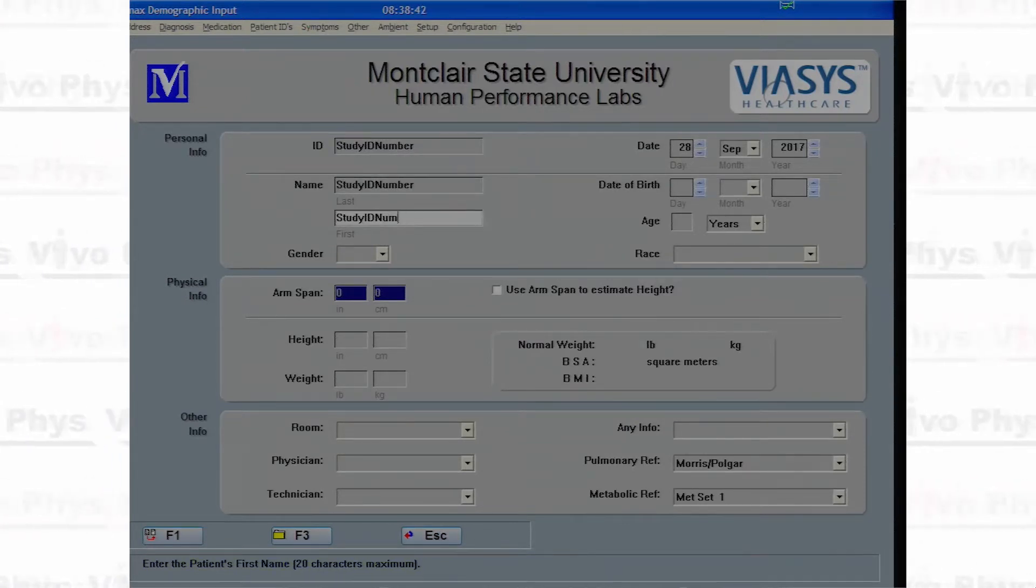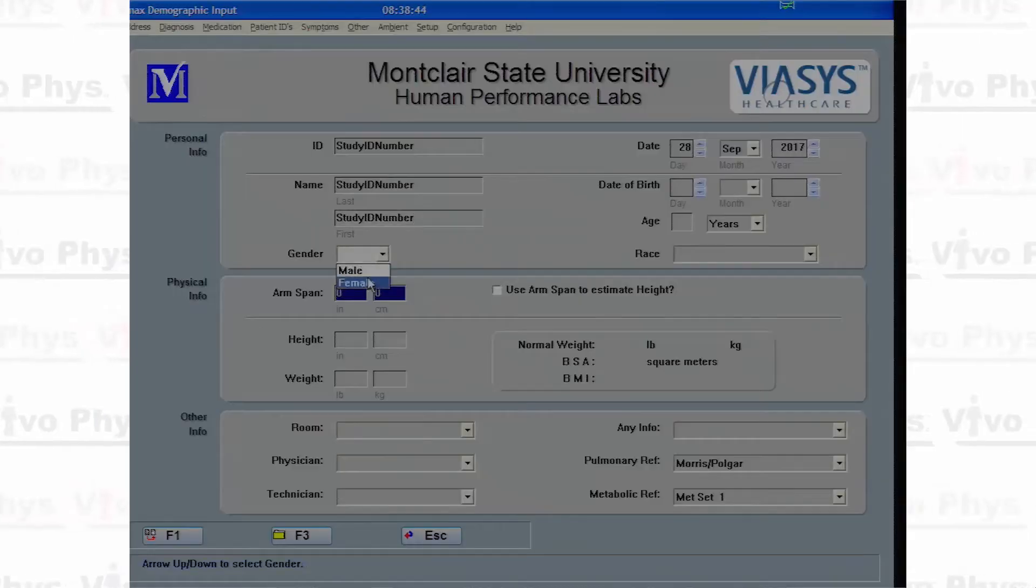If this is for a research study, you're not going to put a first and last name—just their research ID for all three fields. You're also going to want to put in their date of birth, gender, race, how tall they are, and how much they weigh.